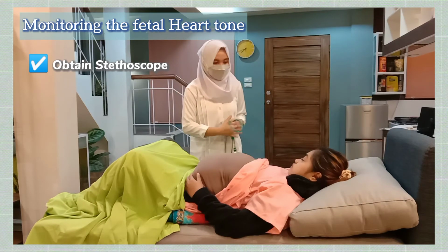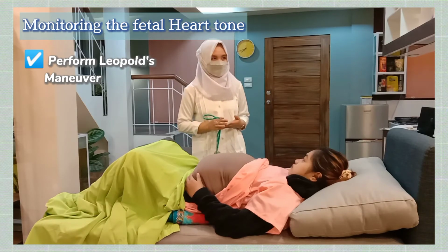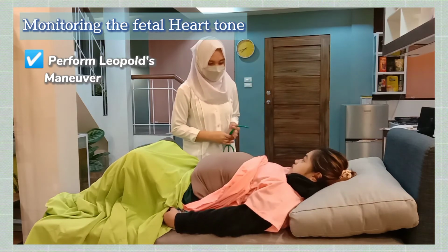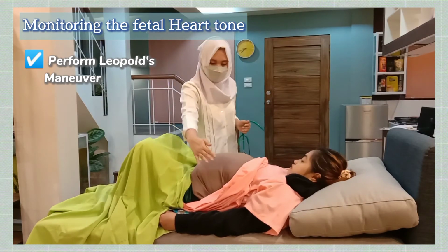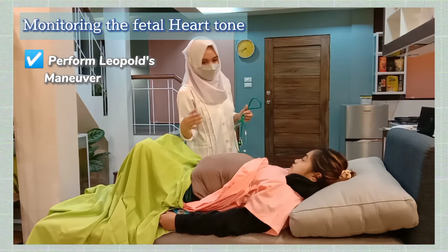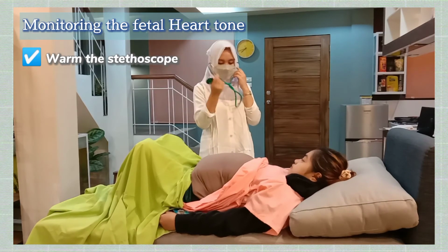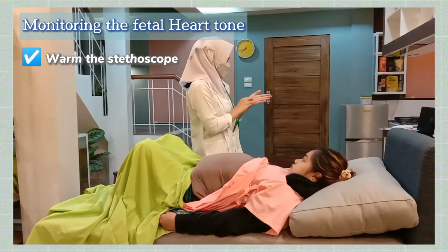Ma'am Sohara, since we have already performed the Leopold's maneuver, specifically the second one, which is also known as the umbilical grip, I now have an idea where the back of the baby is. And since the back of the baby is on your left side, therefore, I will auscultate at this side. Let me warm the stethoscope because we will use the bell of the stethoscope since we are going to auscultate for a fetal heart sound.